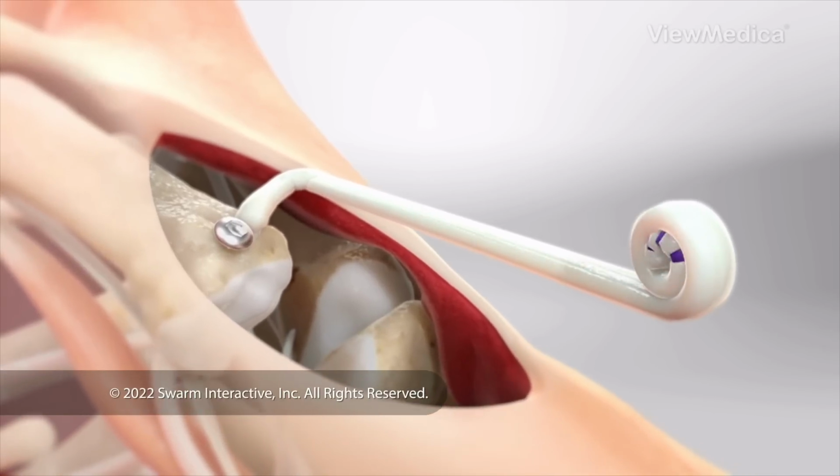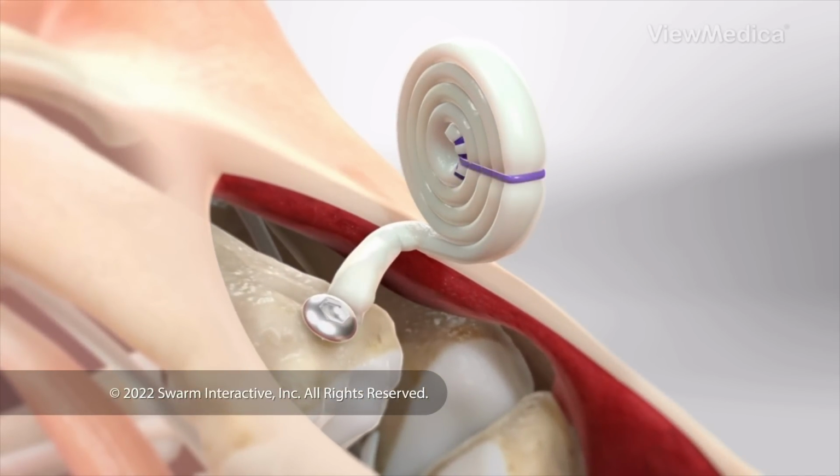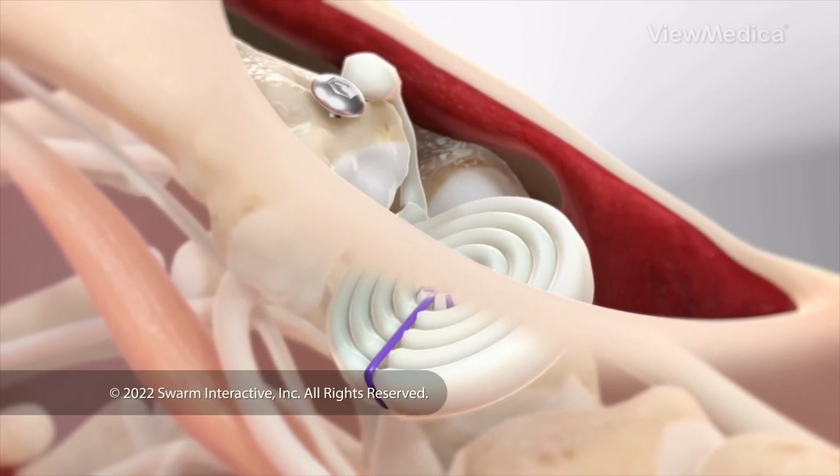We fold the tendon against itself several times. Then we suture it to make a bundle. We put this bundle in the space where the trapezium used to be. The tendon bundle will cushion your joint.